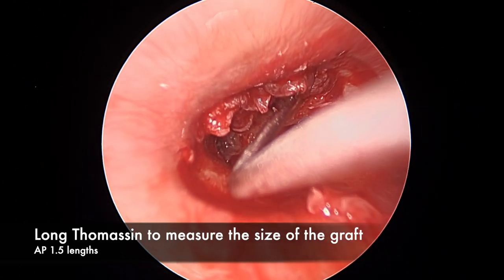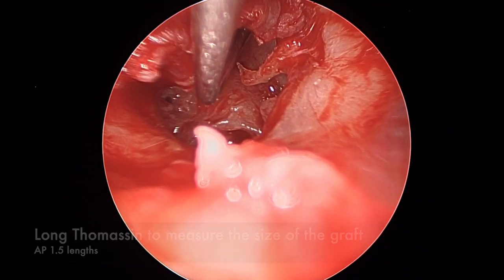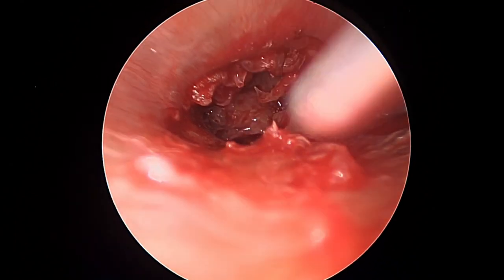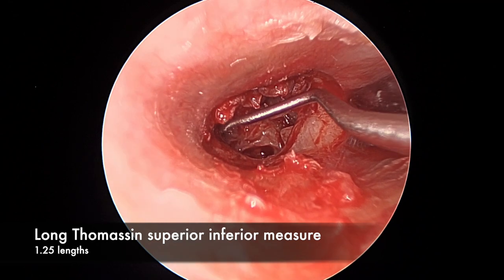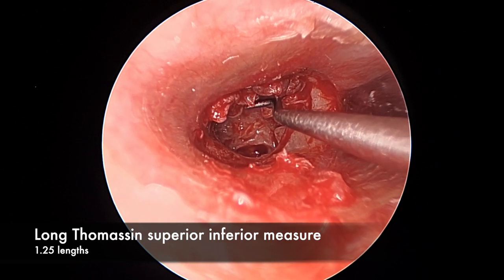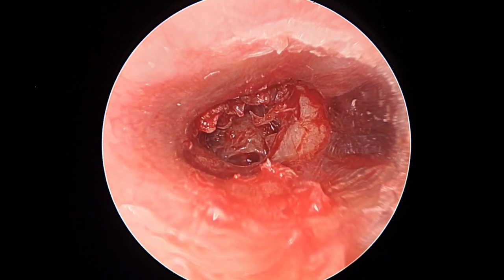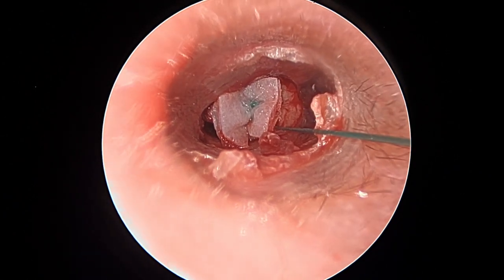Using a long Thomassin to measure the graft — placing the knuckle of the measurer at the posterior bony annulus with the anterior aspect applying itself to the lateral surface of the protympanum. It measures approximately one and a half Thomassin lengths anteroposteriorly and approximately one and a quarter lengths superoinferiorly. The knuckle comes to the midpoint of the malleus, so I extend by about a quarter to cover the short process and the elevated tympanomeatal flap region. A neuropatty is placed and we're ready to harvest the tragal cartilage.